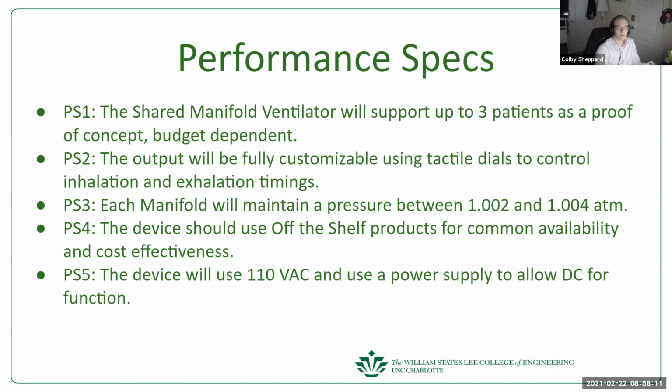Gotcha. I didn't actually take a good look at the power supply that Billy was using, but there's a good chance that it has a 110 220 volt switch on it anyway. I think it does. Pretty sure it does. So I could go look at it right quick. That would solve that problem immediately, I think. And if not, we can get one. That's just one we were testing stuff with.